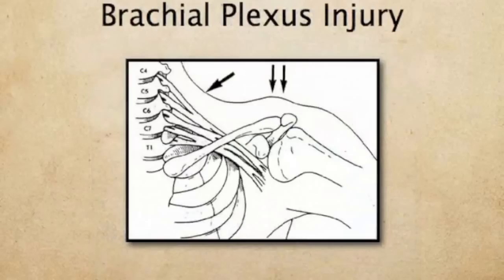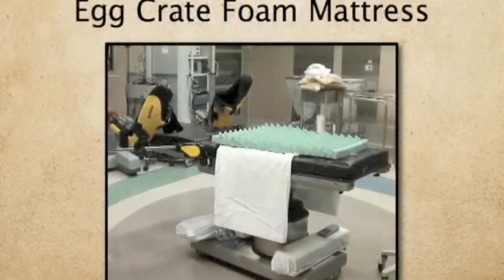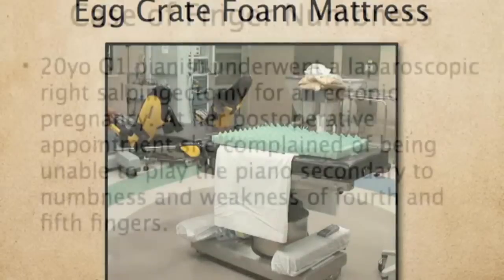Correct placement of the brace should be over the acromioclavicular joint. An alternative to using the shoulder brace, such as using an egg crate foam mattress to prevent slippage, is a better option in reducing the risk of a brachial plexus injury.